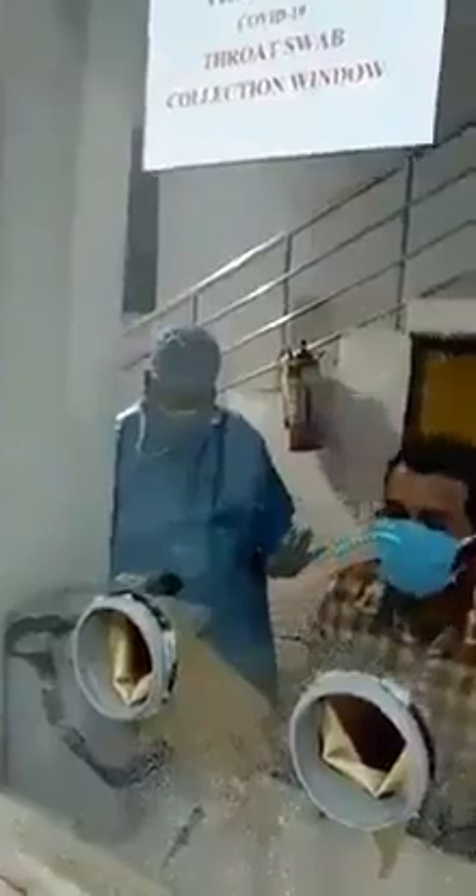The patient is also ready. The area has been sprayed another time, and the doctor is inserting his hands through the glass plate.